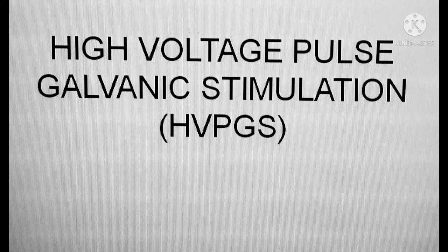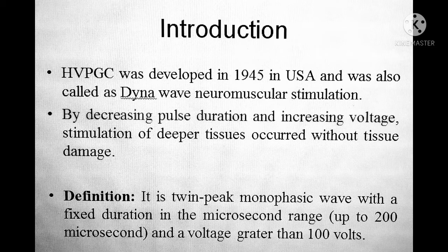Hello everyone, in this video we will be seeing about high voltage pulse galvanic stimulation. Definition: it is a twin peak monophasic wave with a fixed duration in the microsecond range, up to 200 microseconds, and a voltage greater than 100 volts.